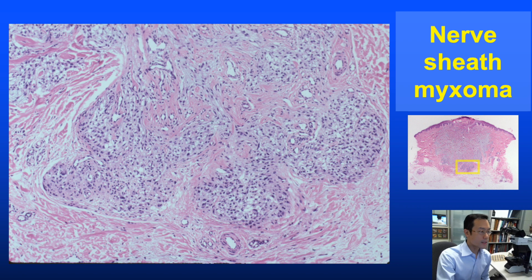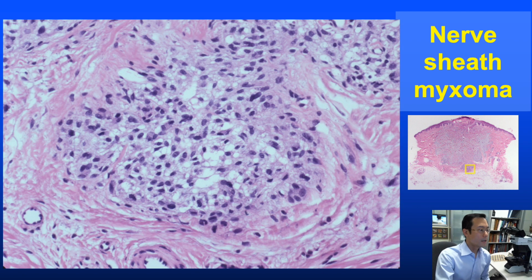And I think we can see here that the growth pattern is a little different from all of the other neural tumors that we've looked at, as well as different from the appearance of intradermal melanocytic nevi. The tumor cells are positive for S100 protein and tend to exhibit a spindled or dendritic profile, and often quite a bit more myxoid stroma than is seen in this example.